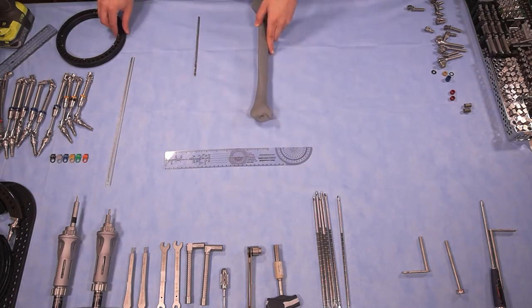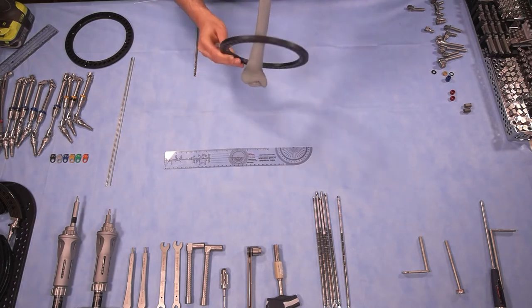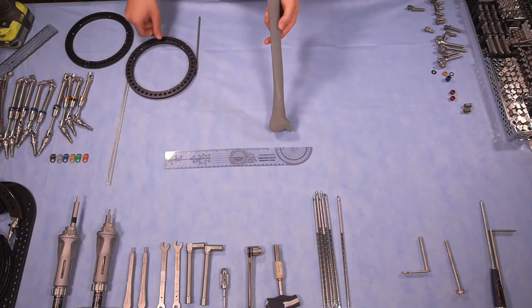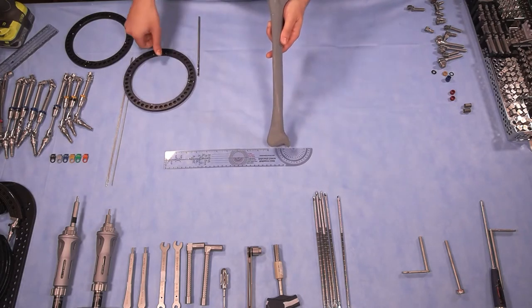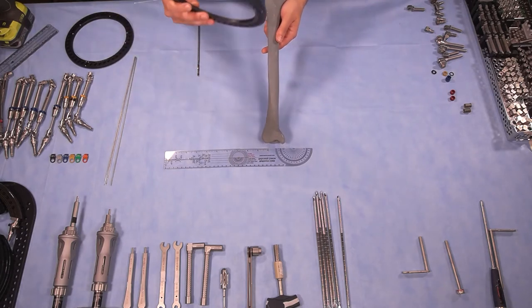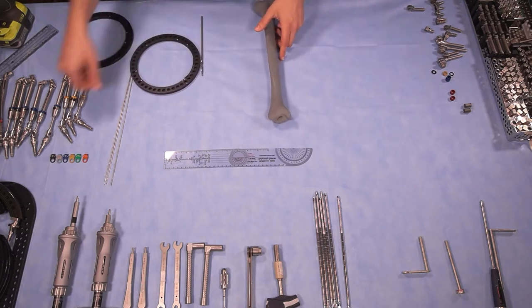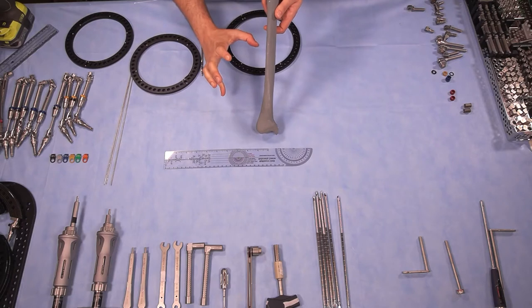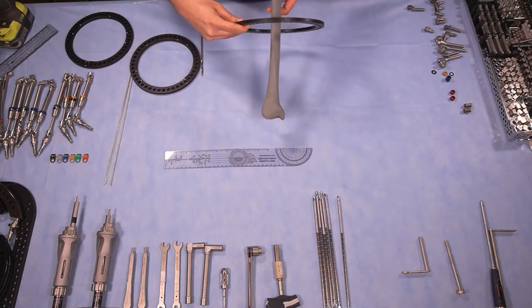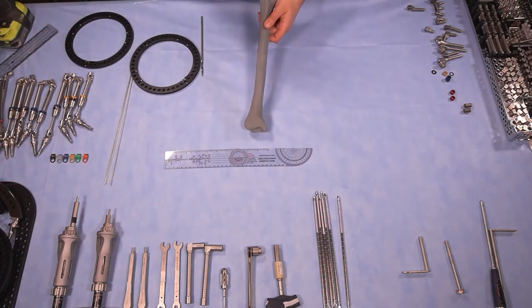Starting with the particulars of this system: we are going to use two 155 full rings — one distally and one proximally. Because we have a nice straight diaphysis, it's easy to apply a ring orthogonal to it, so we're going to use a proximal reference. The rings do not have to be orthogonal to the bone in this system, but for added stability, cosmesis, and aesthetics, we will do this. Ring sizes range from 130 up to 270 millimeters.